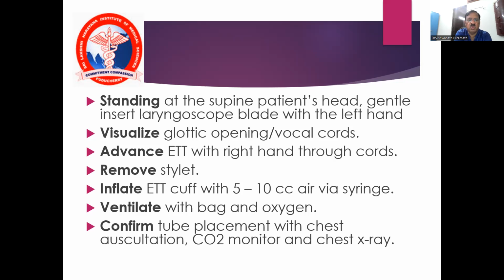The procedure is carried out only if the patient is unconscious, or is made unconscious, or the reflexes have been abolished by induction of general anesthesia, or by a very trained person when there is difficulty in intubation, awake with topical anesthetization of the airway can be carried out.